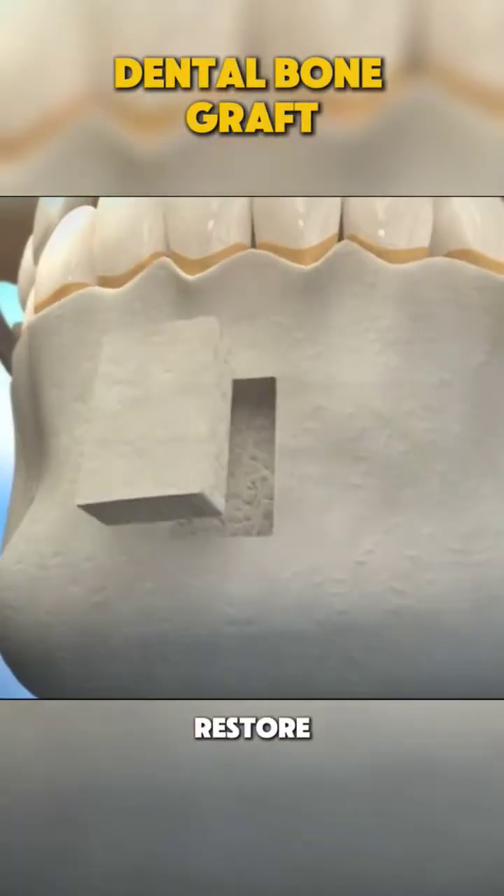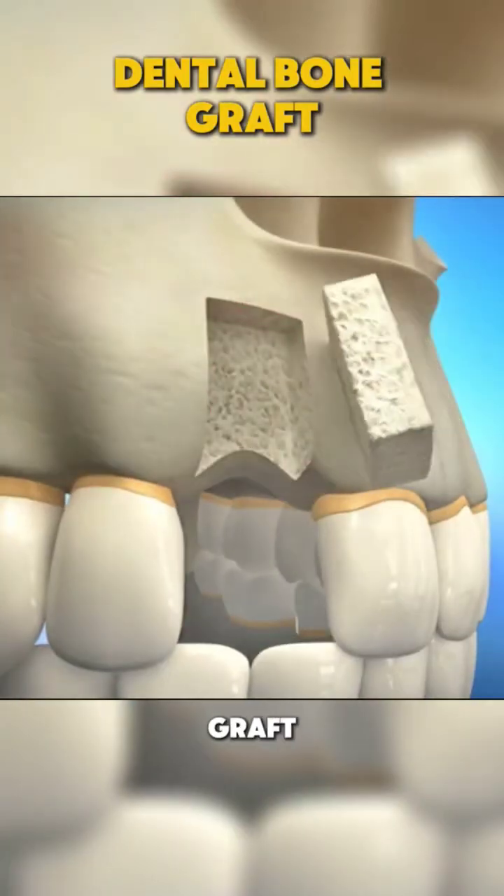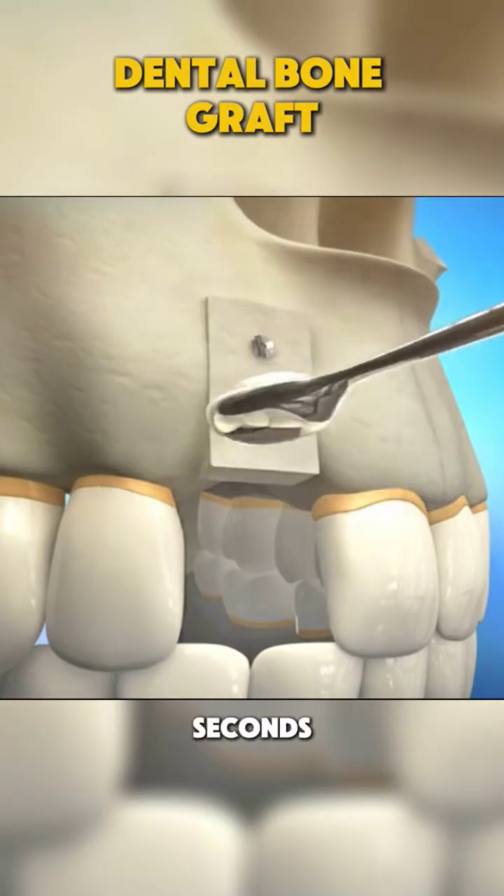Ever wondered how dentists restore lost bone for dental implants? Let's break down the dental bone graft procedure in just 70 seconds.